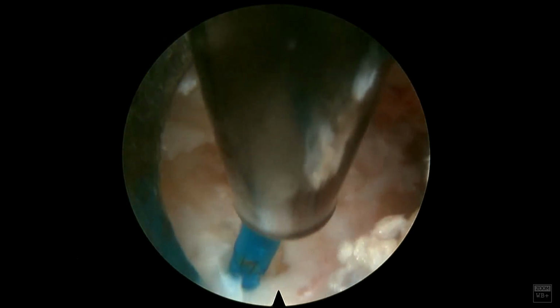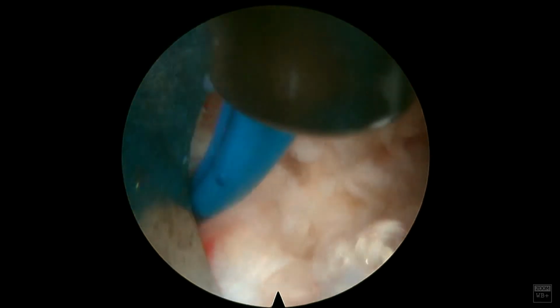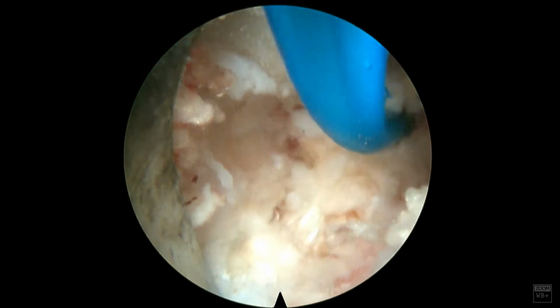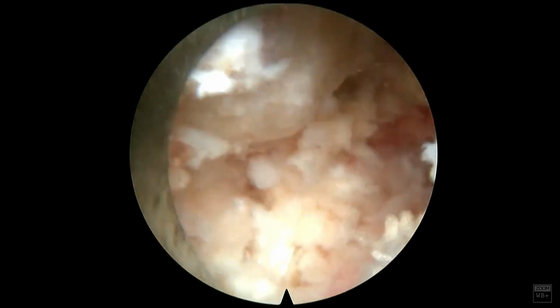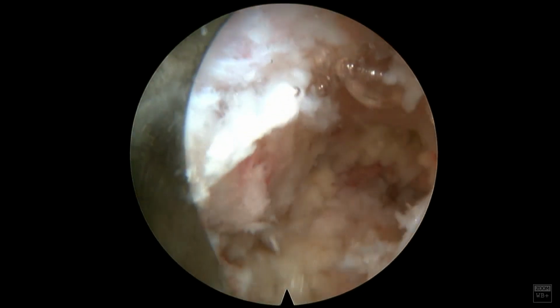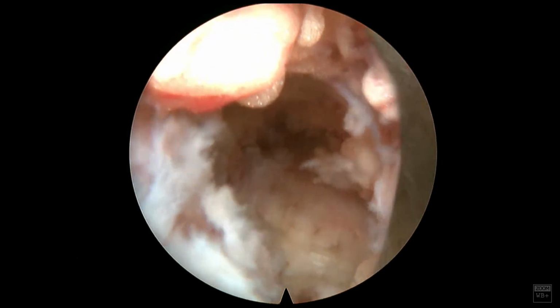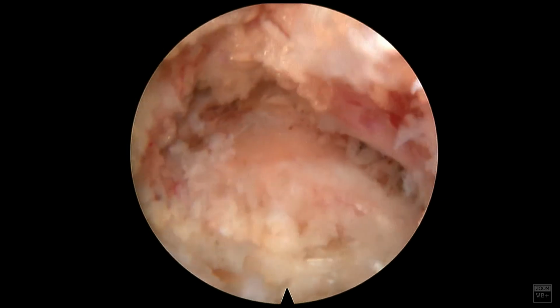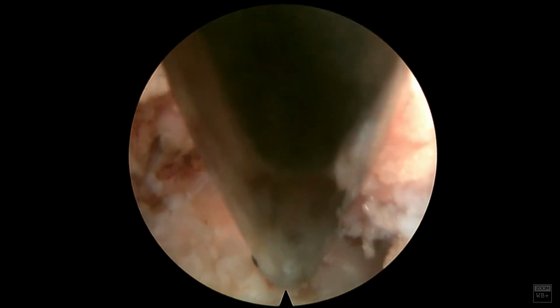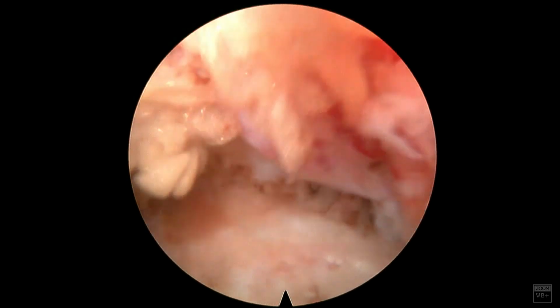Again, I didn't get really into the canal here. I still haven't in my cases, unless they have lateral recess symptoms, spent a lot of time decompressing that area, mostly because I don't like to take blind bites into the canal. There's usually a lot of epidural fat, but I can see the canal pulsations there. You can see here that the SAP is removed, or at least the tip of it, and this is a great view of the L5 exiting nerve, and so I couldn't be happier with getting this decompression.